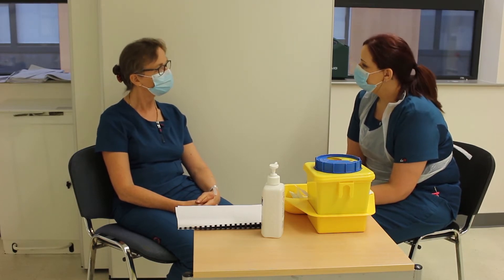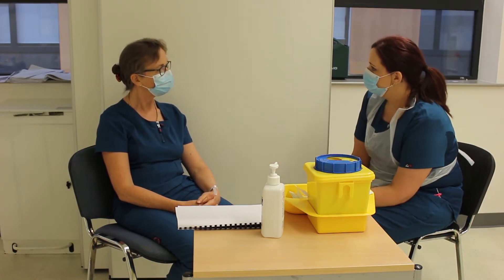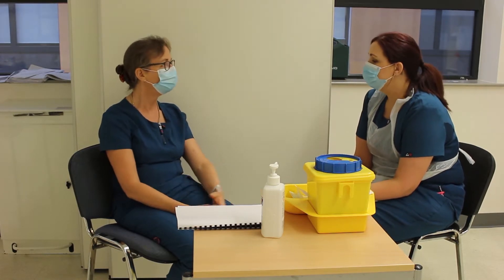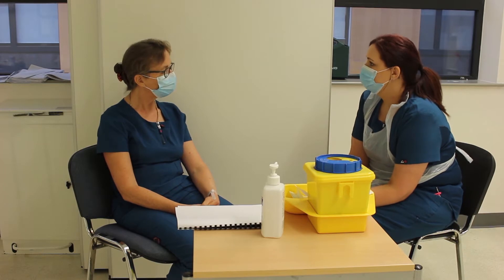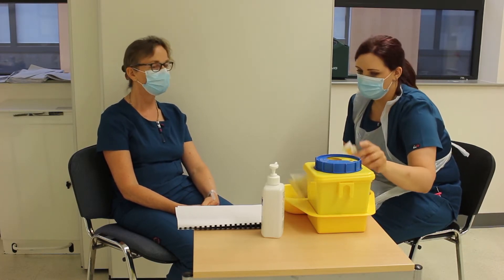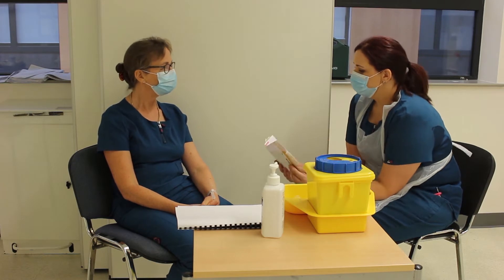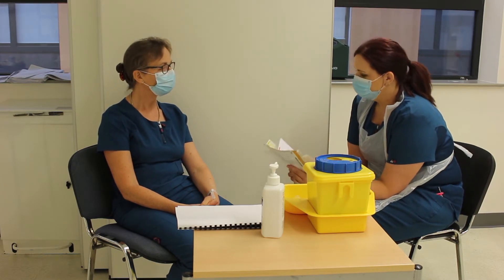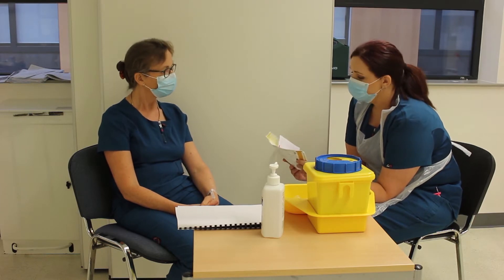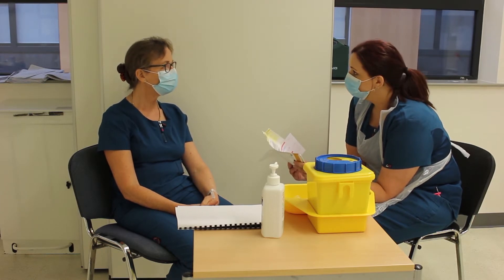Have you had blood taken before? Yes. Are you on any medications to thin your blood — blood thinners or anticoagulants? No. When they've taken blood before, what arm did they use? I prefer this arm. Before I go ahead, I just need to confirm I have the right person — can you confirm your full name for me?